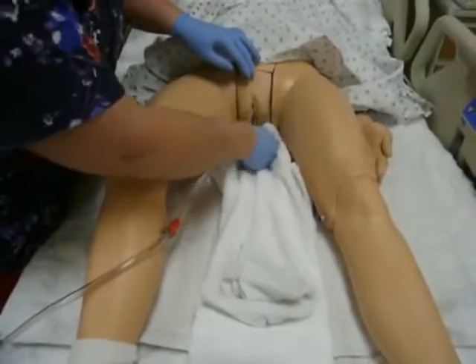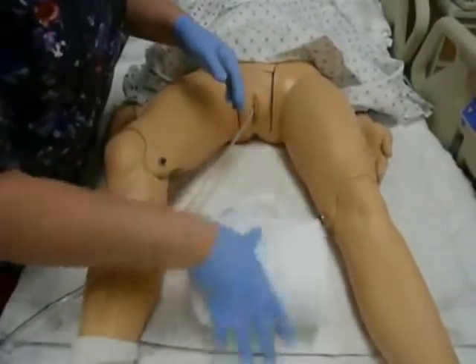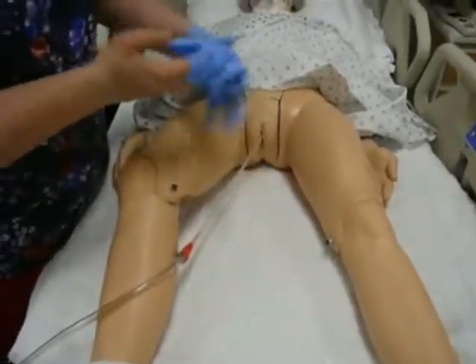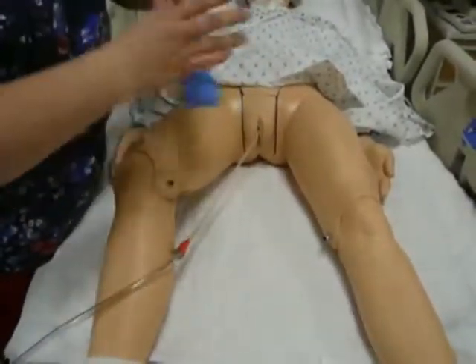When I'm done with that I can dry her, roll that up into dirty laundry, take off my clean gloves, and then with just my hands I can go ahead and get my patient covered.